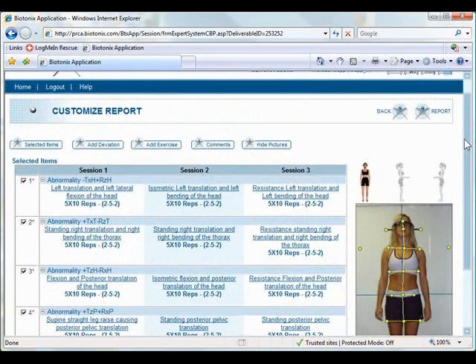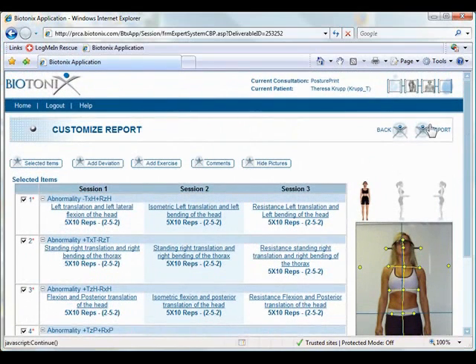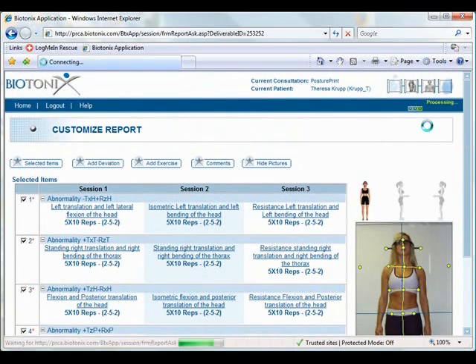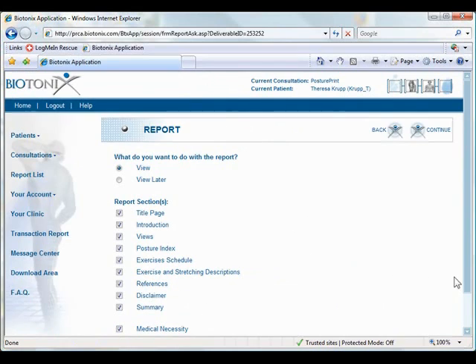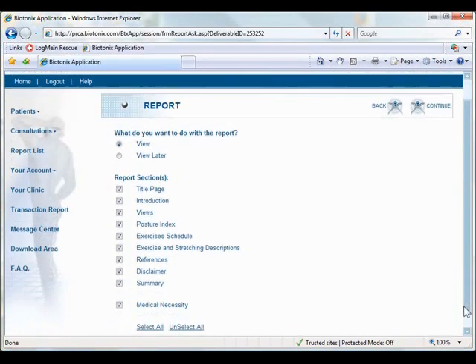So, after we're done here, we hit report. Now, what this will do is it will allow you to choose what you want to include in the report. I'm going to go ahead and include everything in the report.